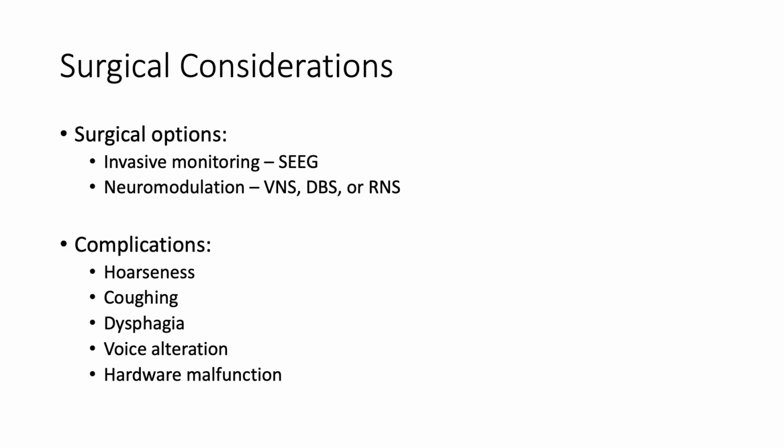The patient's case was reviewed in epilepsy conference. Patient was felt to be a good candidate for neuromodulation. Surgical options and complications were discussed with the patient, and VNS was chosen.